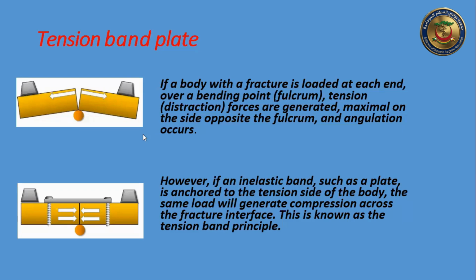The function of tension band is a function, not a device.